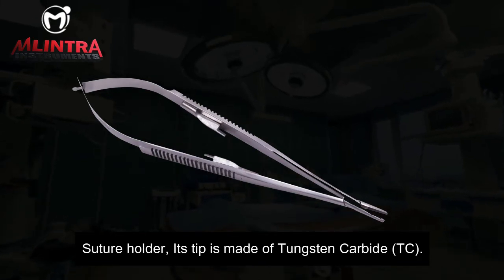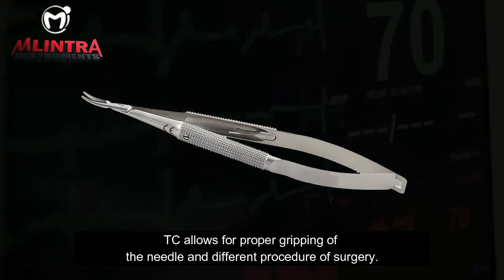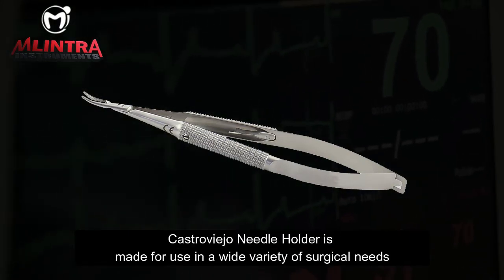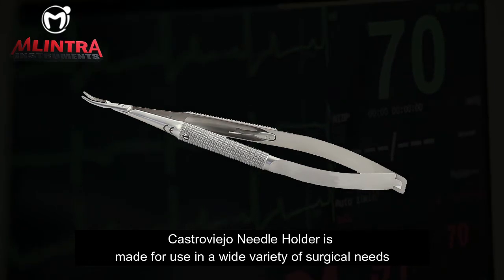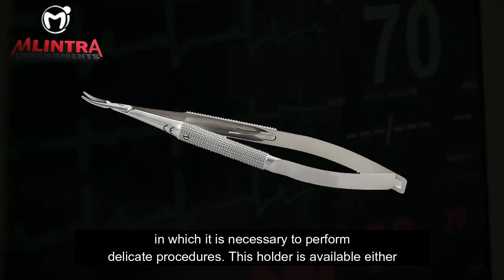Its tip is made of tungsten carbide, or TC. TC allows for proper gripping of the needle in different procedures of surgery. The Castroviejo Needle Holder is made for use in a wide variety of surgical needs in which it is necessary to perform delicate procedures.